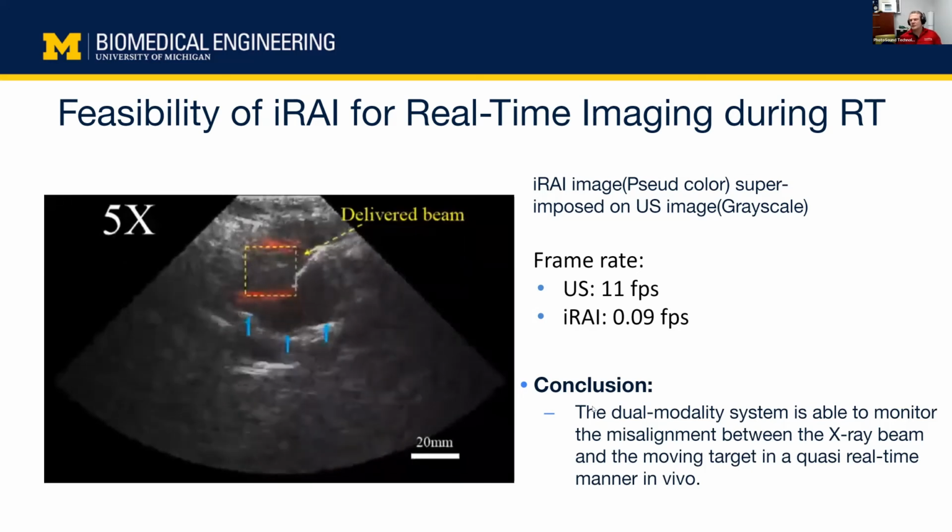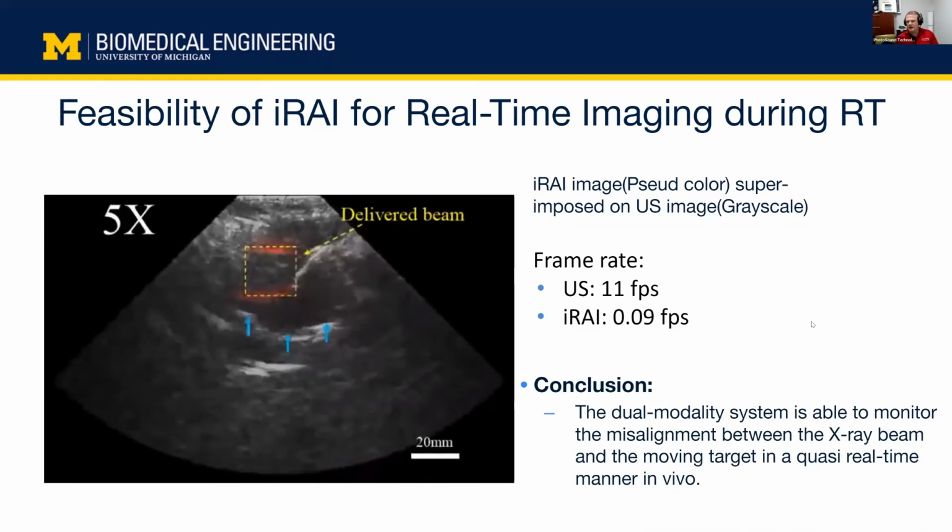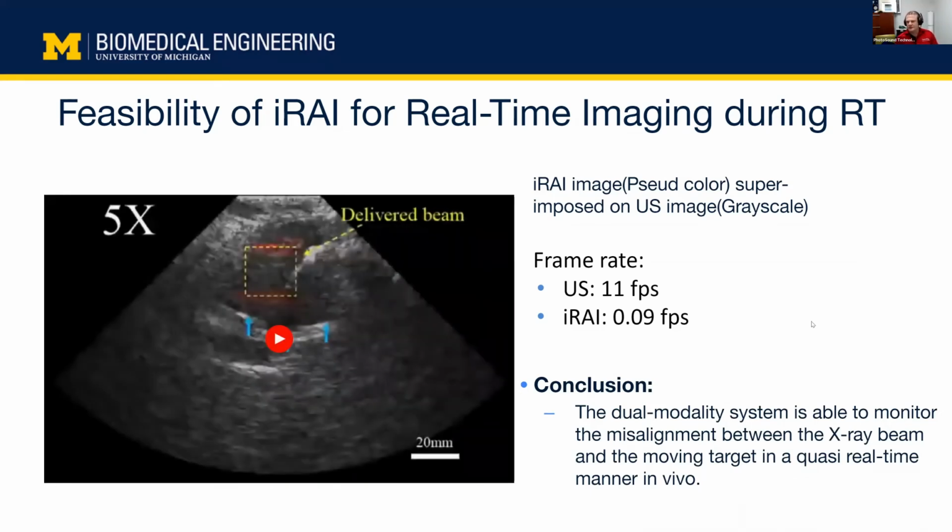What was the pulse duration of your linear accelerator? So typically for a linear accelerator, the pulse duration is mostly 4 microseconds for all the devices. Okay. It's a little bit of a shift, but it's relatively not too much.